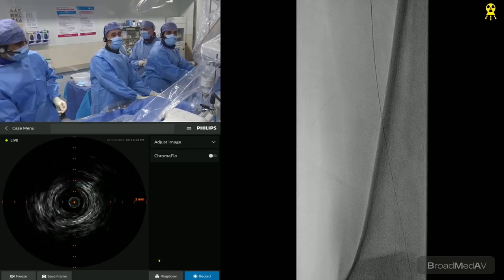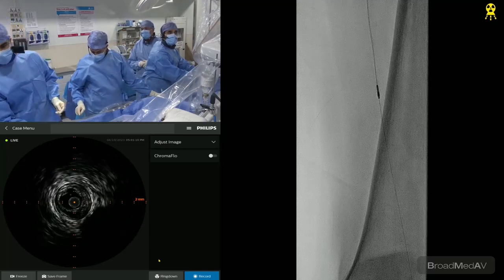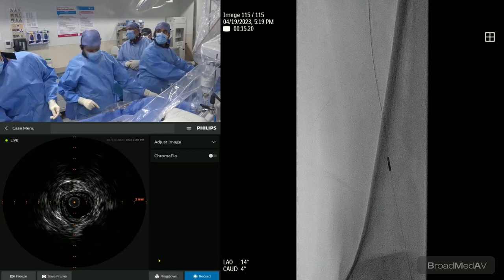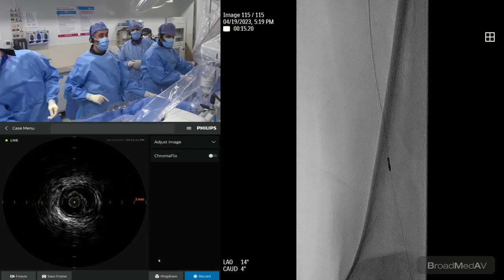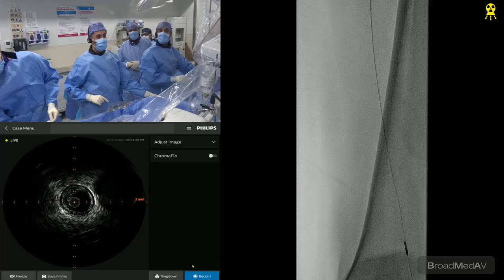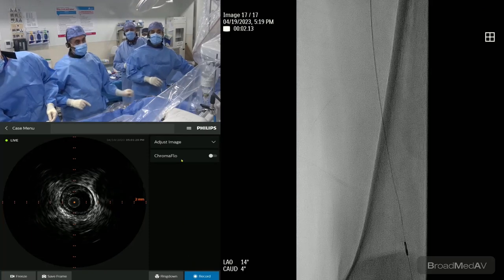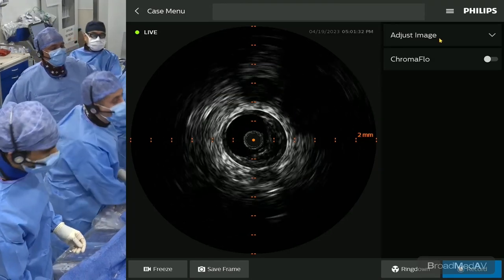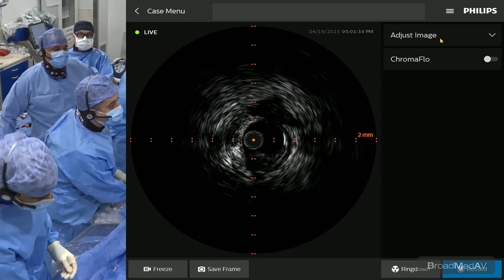Let's go ahead. I want to start from the distal to proximal and take a look. Can you please put up the IVUS images, please? And we crossed. Very perfect. Good. Go all the way down, please, further. Go down further. Wow. So now if you go live on the IVUS image, and Raman, can you go a little further as well? Yeah, of course. And pull back.